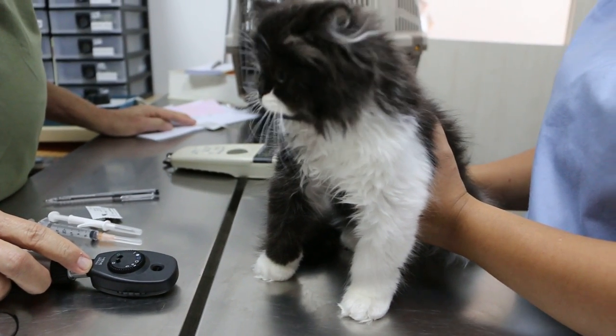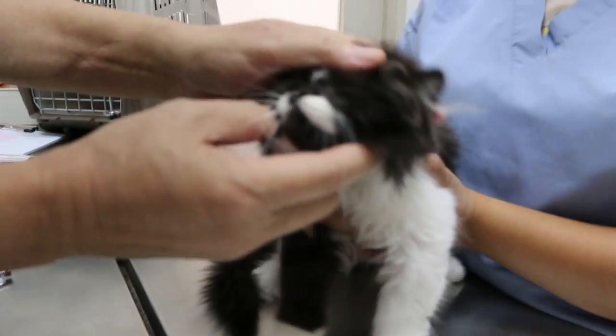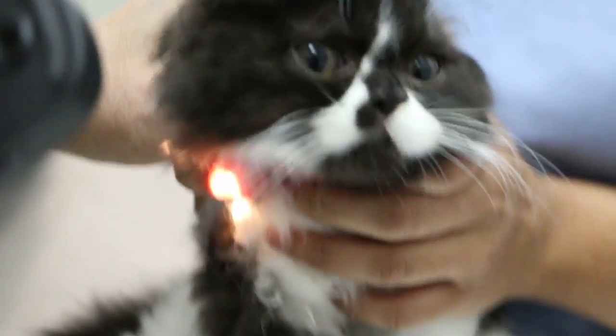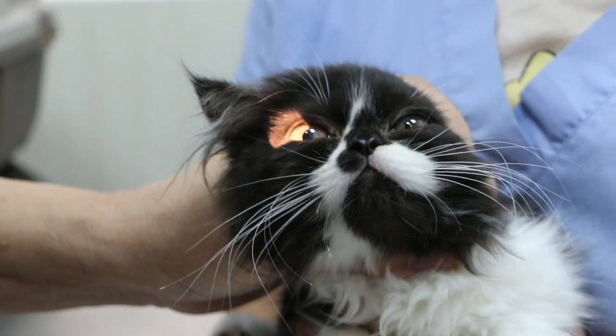18th of October 2018. This is a 3 months old male Persian kitten. I see it's very pretty. Okay, so we did a checkup already, but I just showed one of the examinations, the scoping. You can scope to check for any retina bleeding or not.